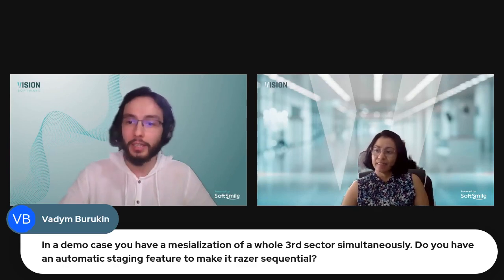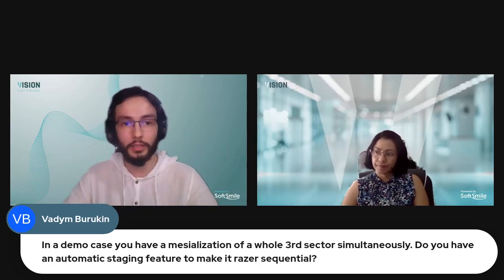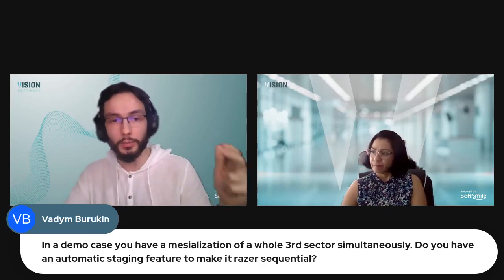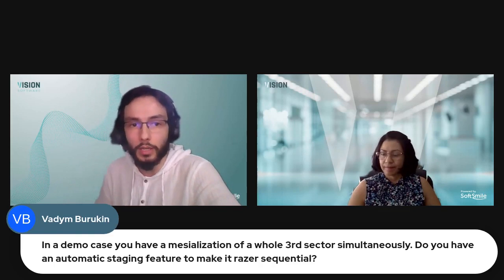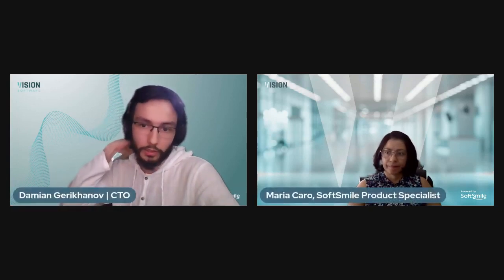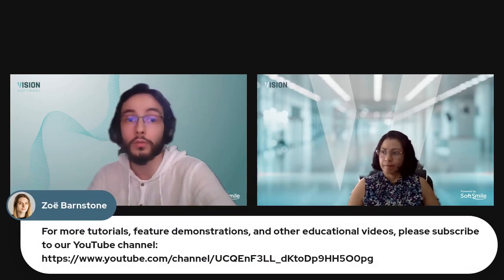Indeed, we do. It's not necessarily going to be purely sequential. It's going to use biomechanical and mathematical optimization techniques to do the sequencing. So it's going to avoid any collision, it's going to minimize the total treatment plan duration, and it's going to happen automatically at the click of a button. Just like Maria mentioned, there are online YouTube videos of how this functionality works. So this webinar isn't really focused on staging, so I don't think we're going to demonstrate that, but there is a lot of additional material on the YouTube channel where you can see all of that at work.